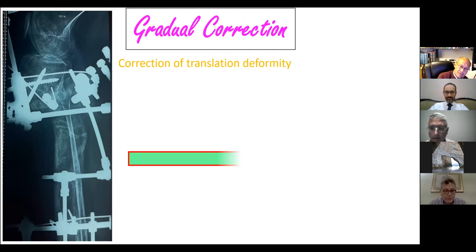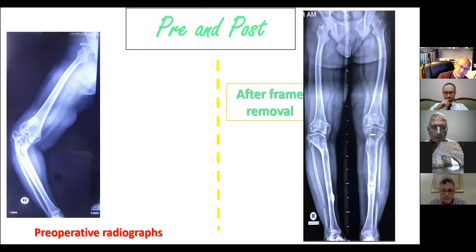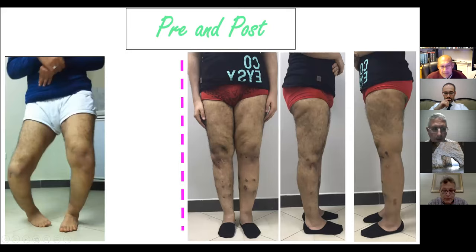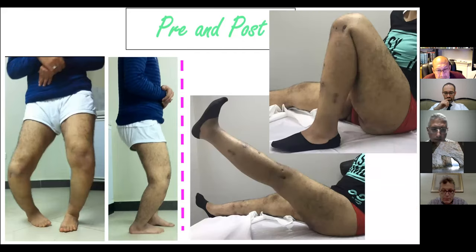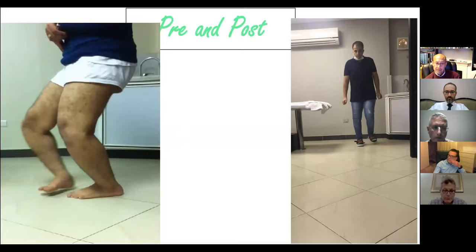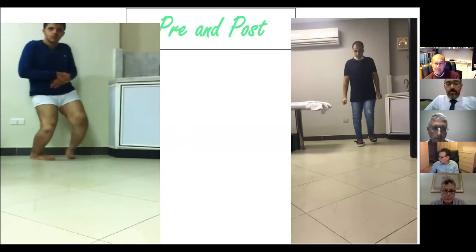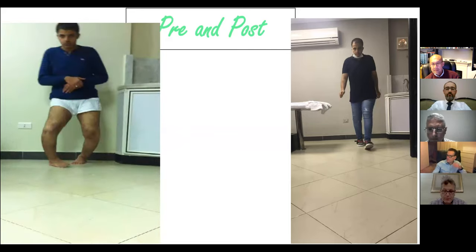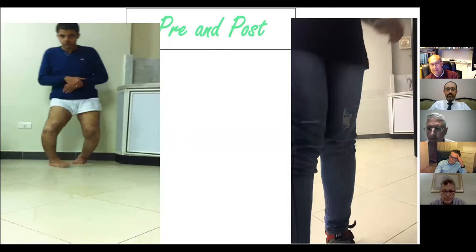This is before correction of the translational deformity, and this is after the correction of the translational deformity, after frame removal. And these are clinical photos of the patient before and after. Range of motion of the right knee, range of motion of the left knee. This is the video of the patient before correction of the deformity. And this is the follow-up video, almost 2 years after correction of the deformity.